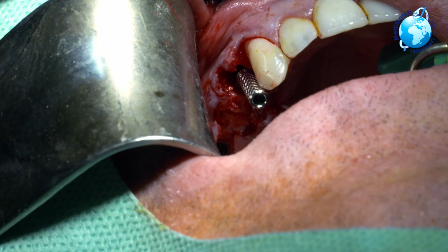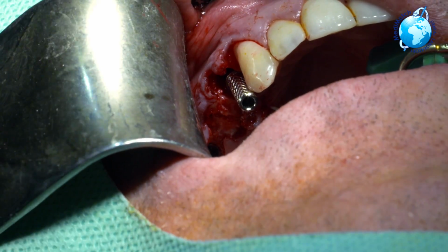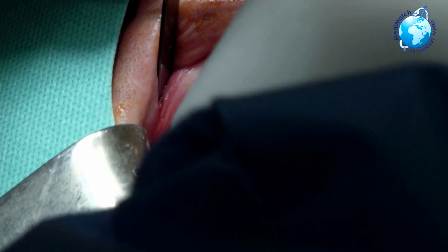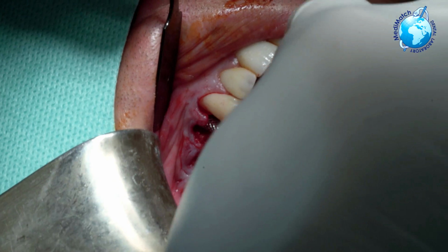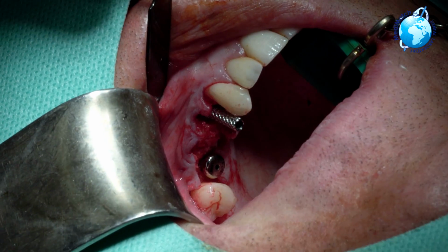It's smaller. The beauty of this connection is that you can hold a healing cap and do this, and it's a Morse taper connection, and it won't drop. So it's pretty secure. It's a very clever invention of this system. There we are, and that's the healing cap on.